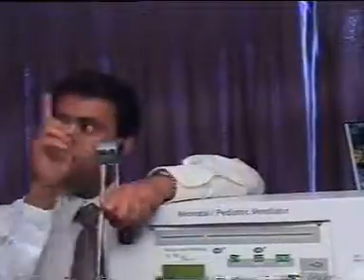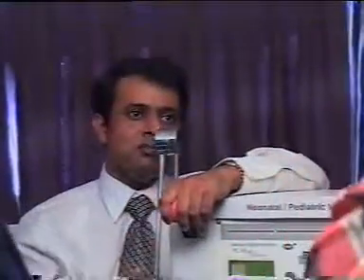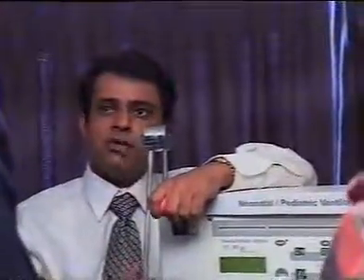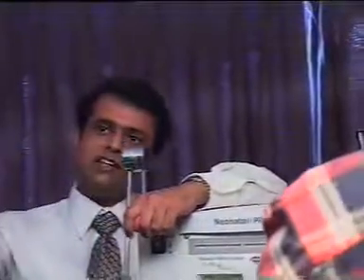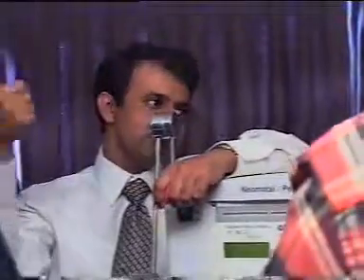If you increase the FiO2 by 1%, the PaO2 increases by 7. So if I set 80% and my PaO2 is 100, and I make it 81%, that increases by 7. It becomes 107. This is how it goes on increasing.